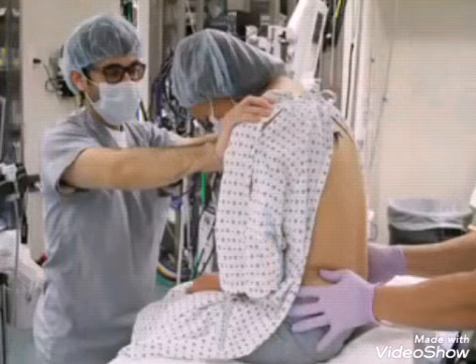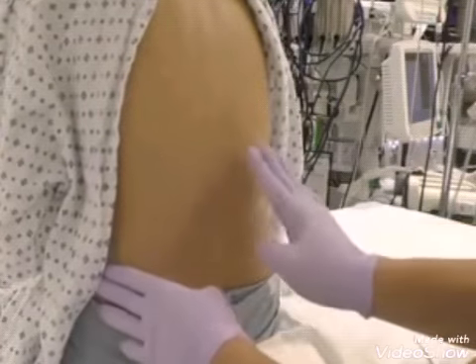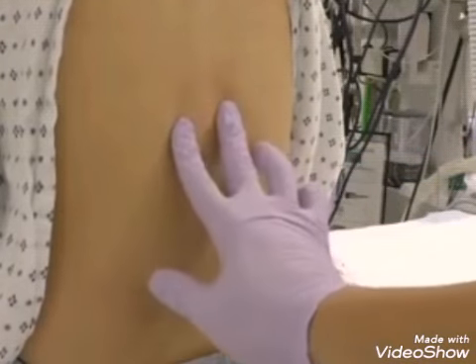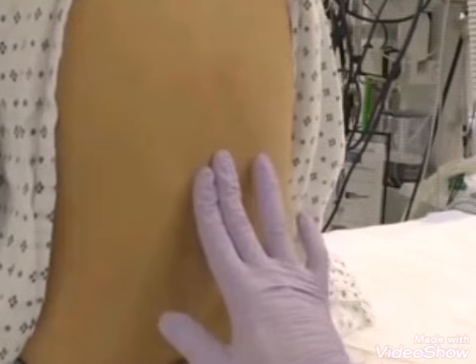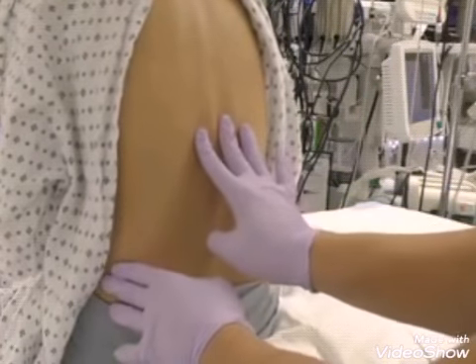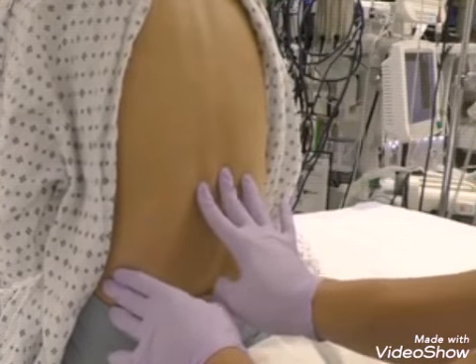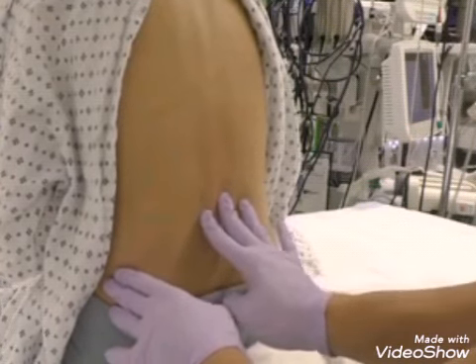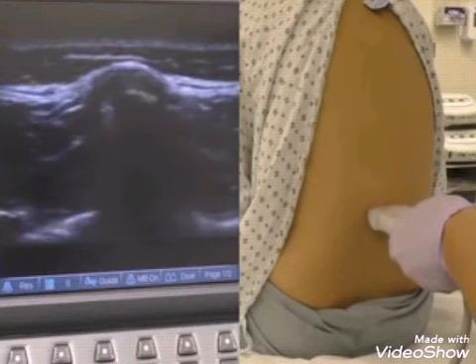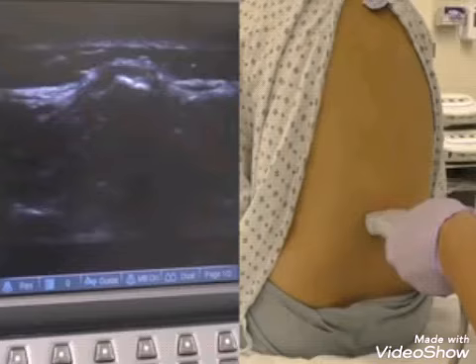Once the patient is in this position, begin to palpate the anatomical landmarks of the back. Although the epidural catheter will be placed at the level of a lumbar vertebra, palpating the thoracic spinous processes first may help you find the midline more easily and may allow you to detect any abnormal curvature of the back, such as scoliosis. The spinal anatomy may be more difficult to palpate in obese patients. Recent literature supports obtaining pre-procedure ultrasound of the back to identify the midline, particularly in obese patients.